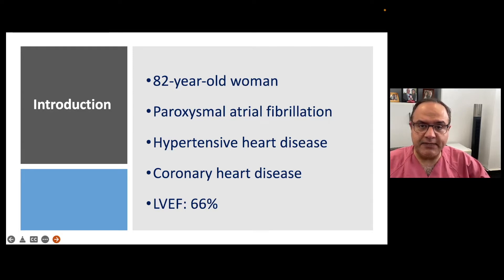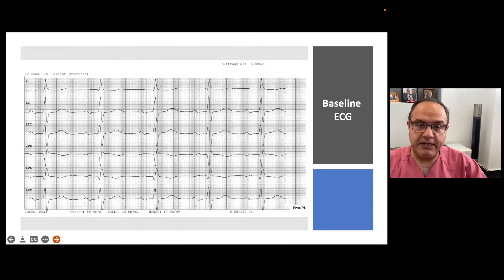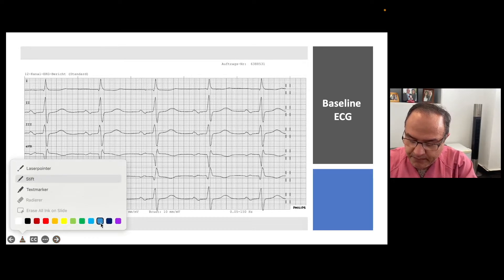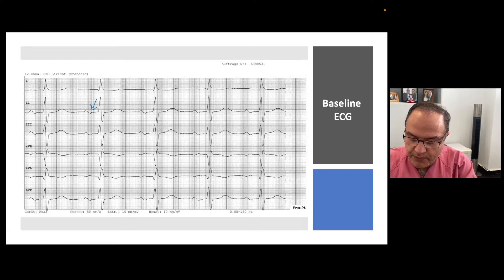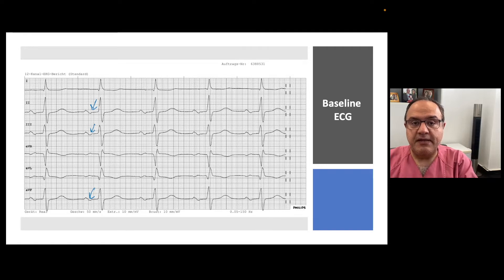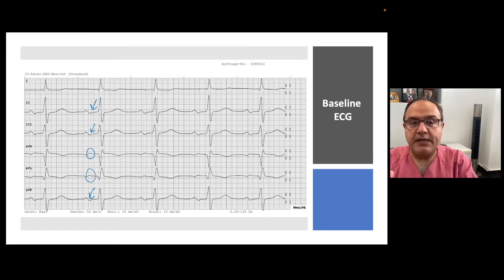Now let's look at the ECG. We see that the PR interval is prolonged. When we look closer at the P wave morphology, especially in leads II, III, and AVF, we see that the second part of the P wave — which shows left atrial activation — is negative. In AVR and AVL it is positive, as you can see here.